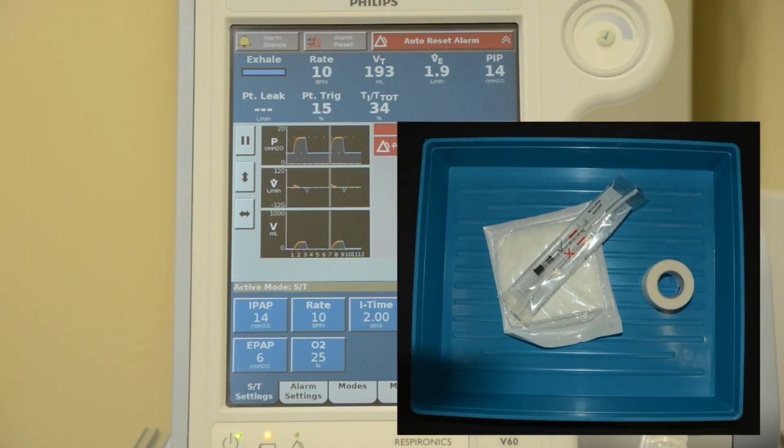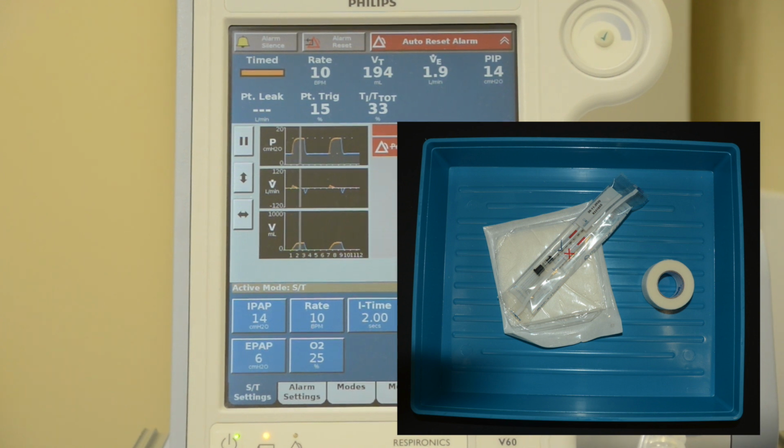An arterial blood gas should be taken 1 hour after NIV is started to assess the patient's response and guide any further adjustment of settings. Try not to make any adjustments in the 20 to 30 minutes prior to taking an arterial blood gas, as these changes will not be reflected in the blood gas results.